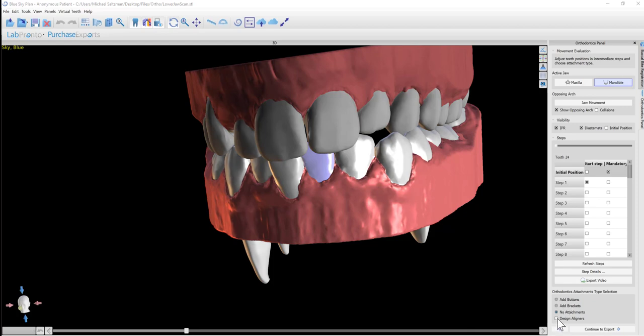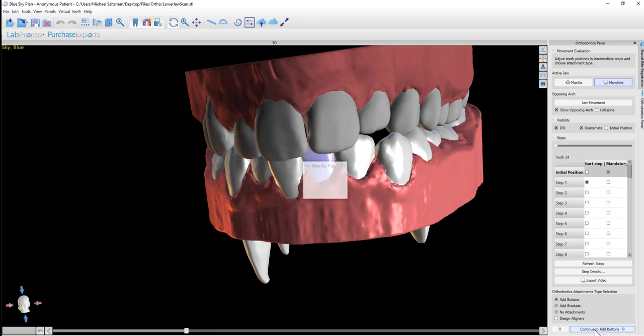We also have design aligners, which actually allows you to design aligners in the software, and they could be exported as STL files. So once there's the relevant printing material, then we could actually have the ability to print the aligners directly. Right now we're going to click add buttons, and we're going to continue to add some buttons.